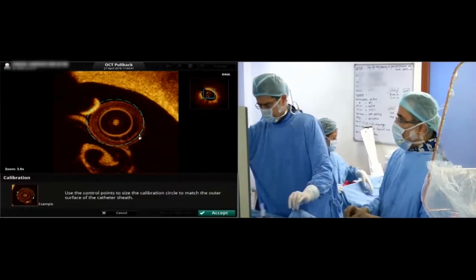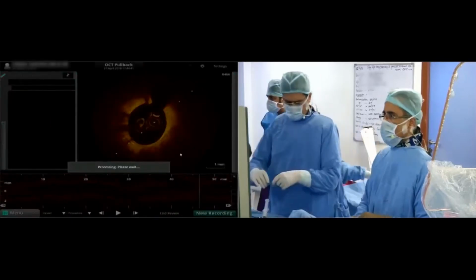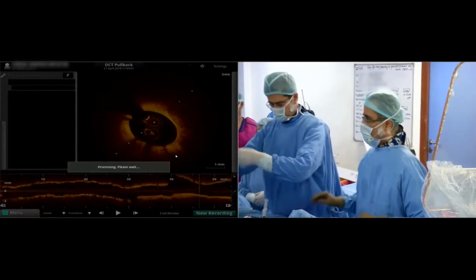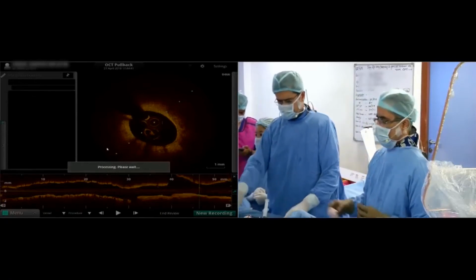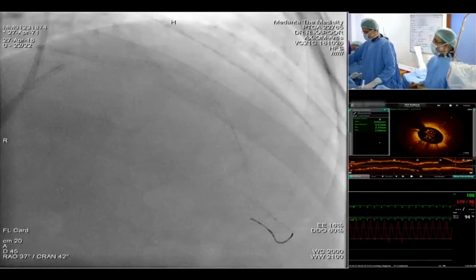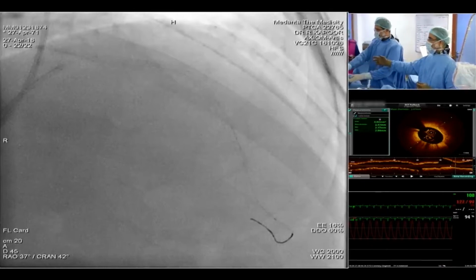So it's a stable plaque otherwise, but let's see the area. FFR. So it's quite reproducible, almost the same, 4.82, and previous analysis was 4.9. So from this aspect it looks significant. Let's see the FFR measurement. FFR.